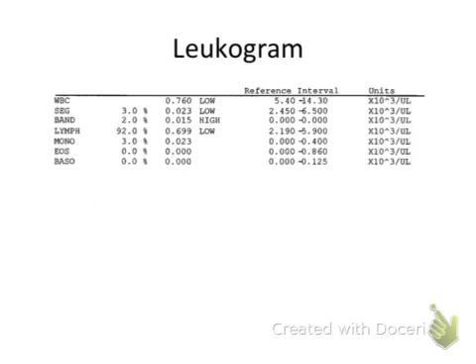The leukogram is a snapshot of the leukocyte concentrations in blood, so it's essentially the leukocyte component of a CBC or complete blood count. In this leukogram, there is a list of each white blood cell type, followed by their relative concentration and their absolute concentration.